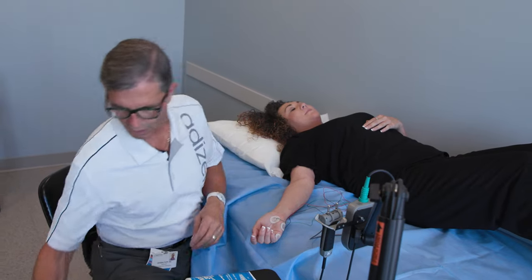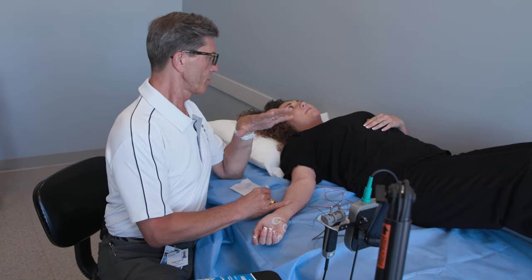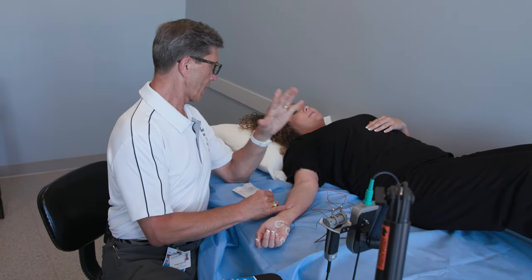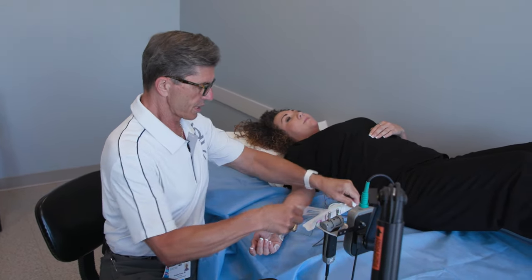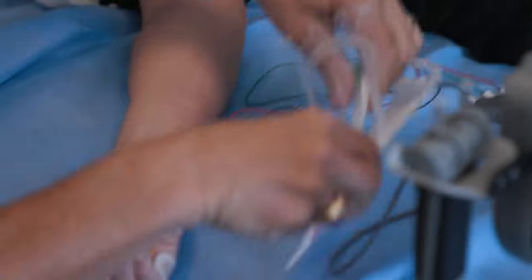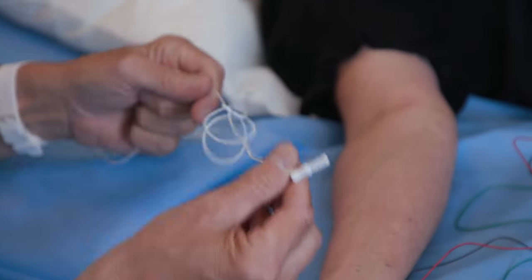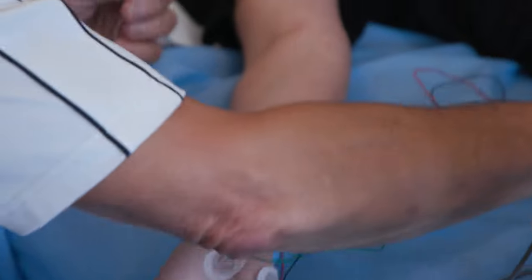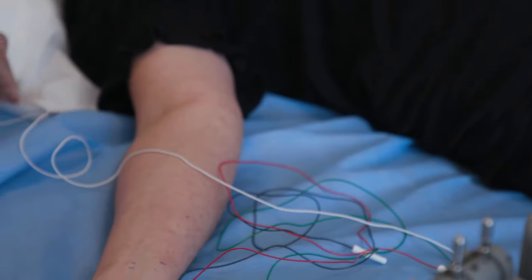We've finished the part where we stimulate the nerves. We're going to switch gears and you're not going to feel any more shocks. All you'll feel now is a little tiny needle pinch — it's an acupuncture-sized needle. So you do feel a pinch; it's not zero discomfort, but it's not horrible. This needle is only going to be recording electricity that your muscles make, so it doesn't put anything into you. There's no shock associated with the needle. You will hear some electronic static-type noise, and that's what I'll be analyzing to see if it's normal or abnormal.